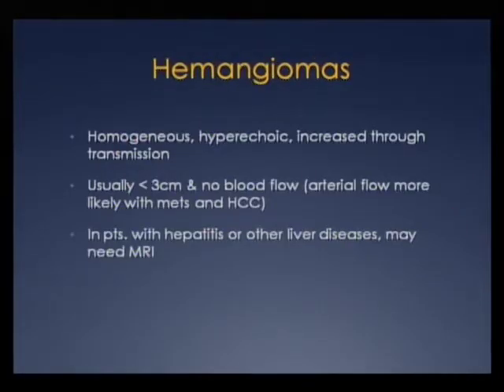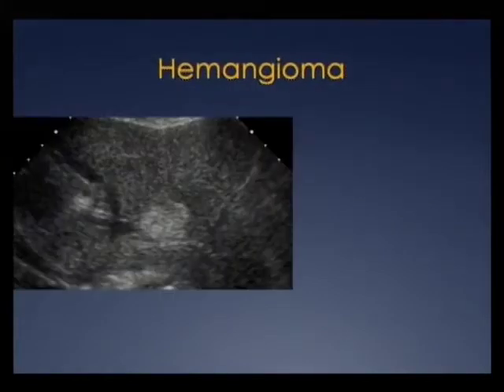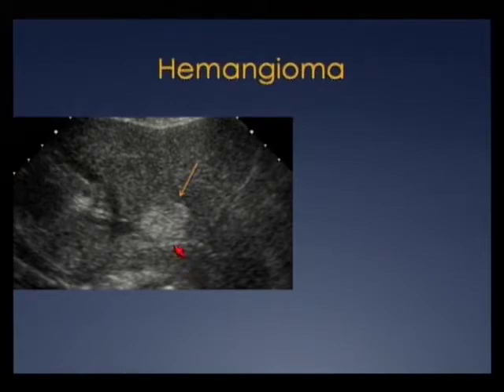Hemangiomas are common, especially in young patients. The hallmark is that they're homogeneous, hyperechoic, and have increased through-transmission. They're usually less than 3 centimeters and are not associated with increased blood flow. If you see blood flow, consider metastasis and HCC in your differential given the patient's history. In patients with hepatitis, cirrhosis, or other liver disease, you may need MRI for further characterization. Here's a uniformly echogenic lesion in a young patient with no risk factors — I'll call this hemangioma and not follow this patient. However, if the patient has HCC, hemochromatosis, or other liver disease, I'll get an MRI for confirmation.